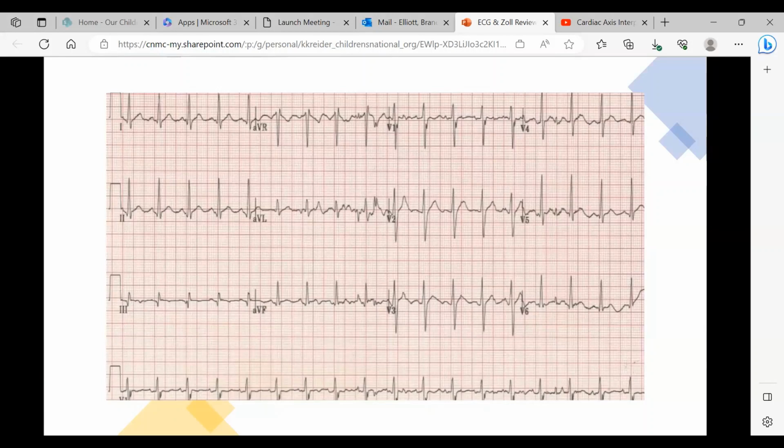I don't think I see ST elevation. Right, Lincoln says no. Yep, no ST elevation present. This is an NSTEMI. They may be having some type of chest pain event that's not completely occluded, so they'll have presenting signs, but there's not necessarily anything on the EKG to represent those changes just yet, and it may change later. That's why it's important to do a 12 lead early and then retake a 12 lead.